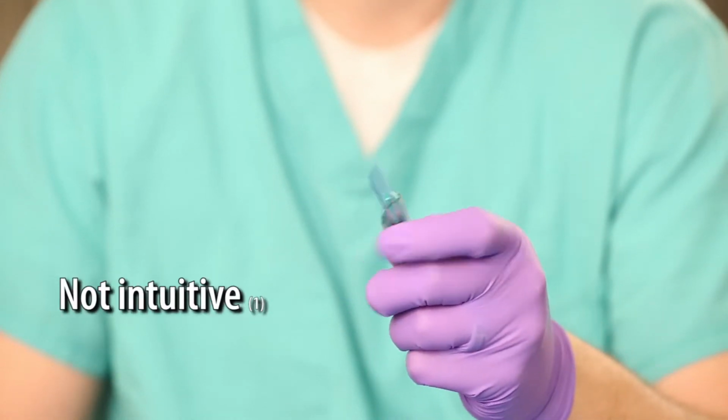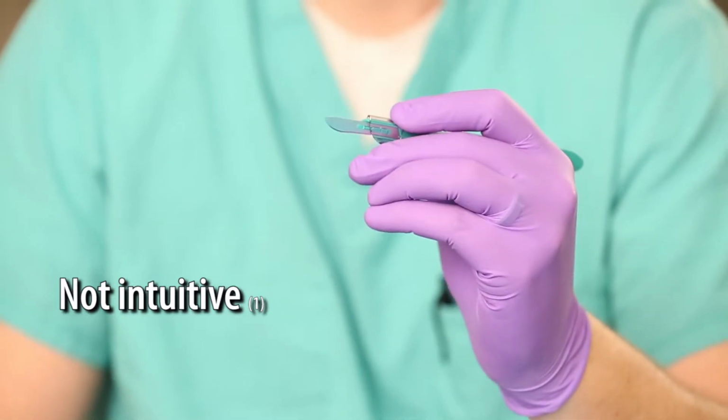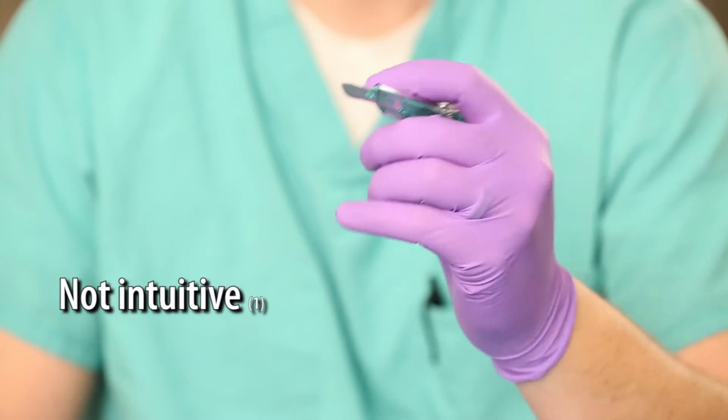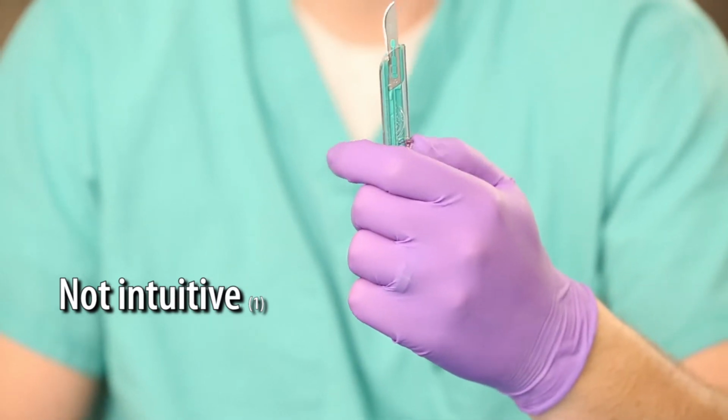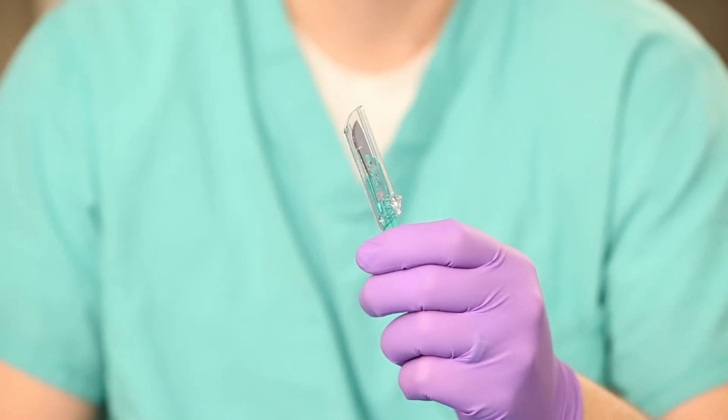Again, I'll illustrate this by showing that when I go to a pen-like cutting motion with the sheath type scalpel, my fingers cover the safety feature, and I have to reposition my hand to retract the sheath. This often discourages users from making this safe.